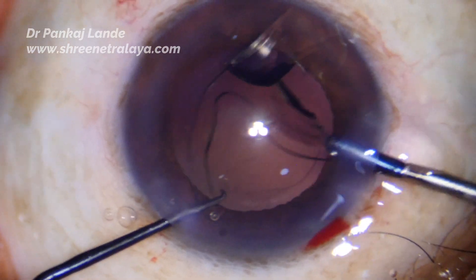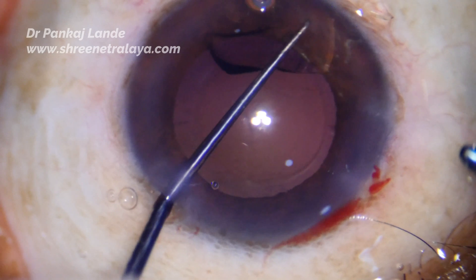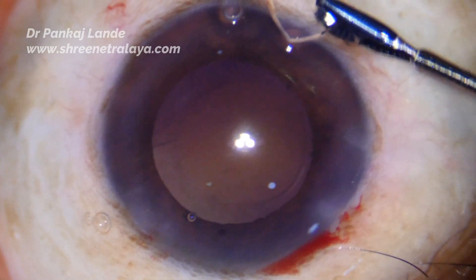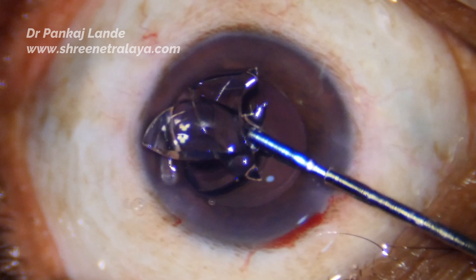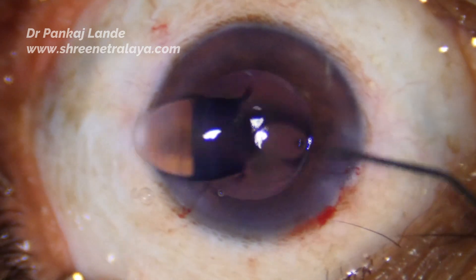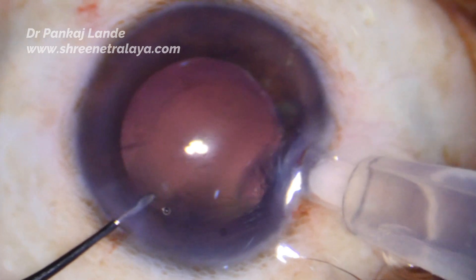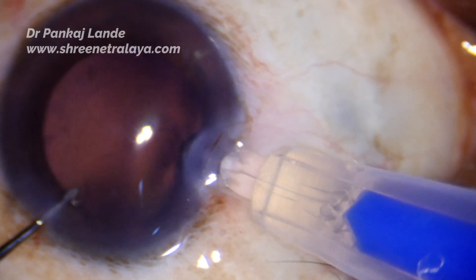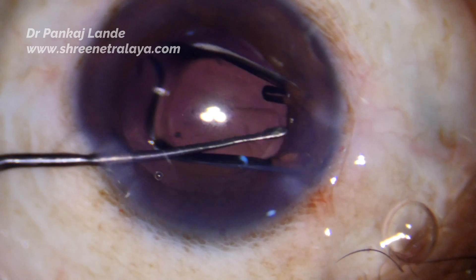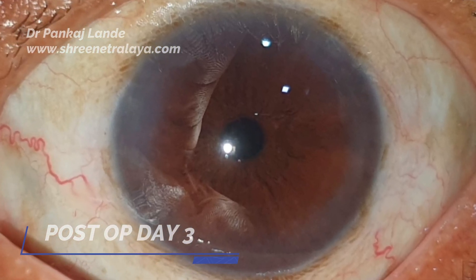Do not rush — have all instrumentation ready and then only start the IOL exchange procedure, because some special instrumentation is required and you need slightly more time to manage things comfortably. The second IOL is injected in the bag and the surgery is completed. Luckily I didn't have much trouble managing this case. This was my first case of IOL cutting with this tool and it was a great pleasure — the postoperative results were awesome. Thank you and good day.